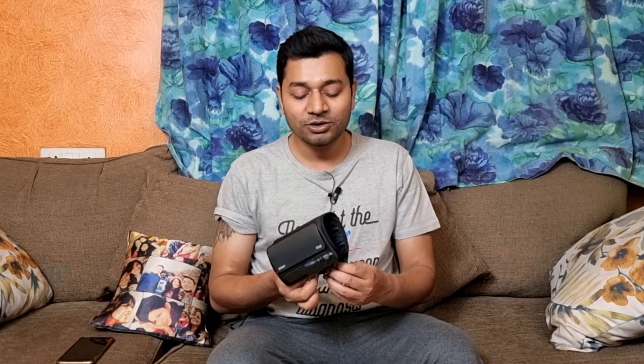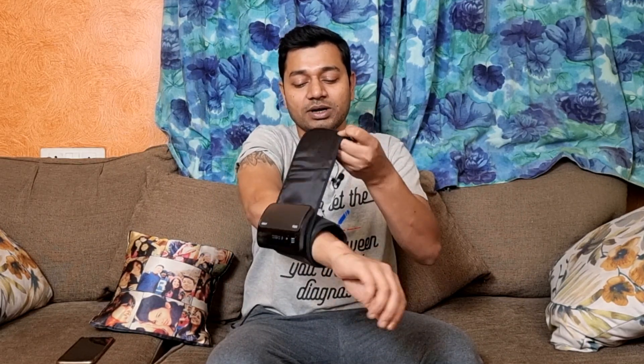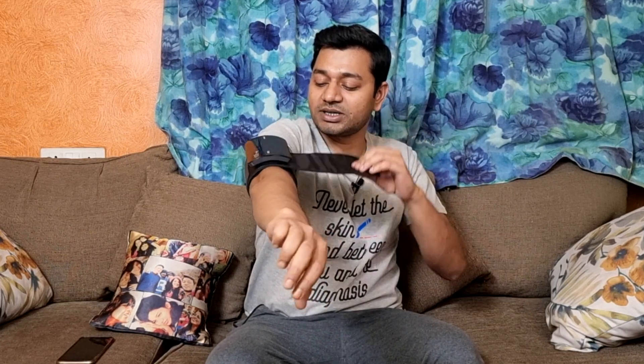The regular blood pressure can be monitored, and then the phone will be able to keep the data via Bluetooth. We can see how compact this is. In the strap, we don't have to hold our hands in a specific way — just wrap it on.